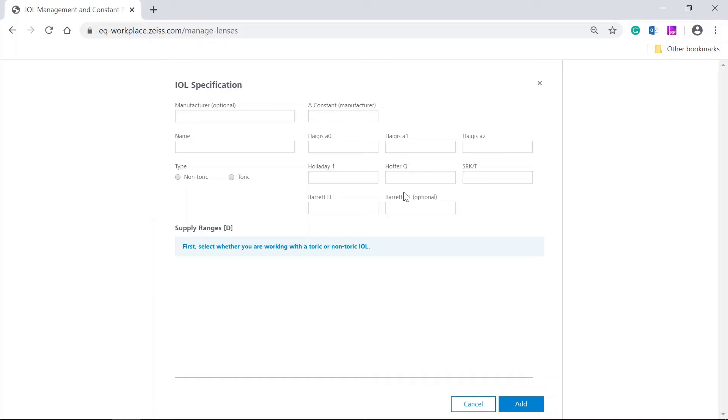The input fields Barrett DF and Manufacturer are optional. All other input fields must be filled out.